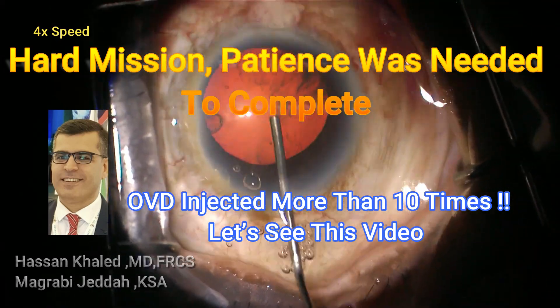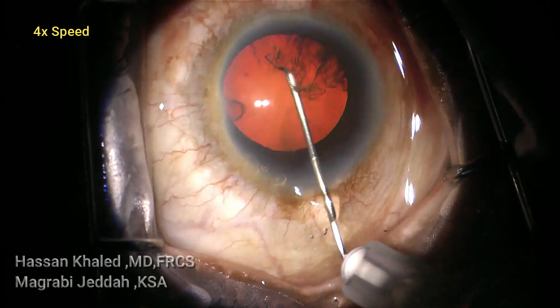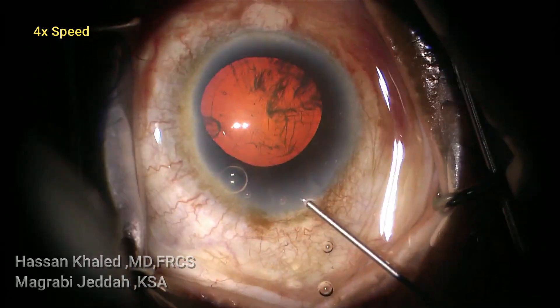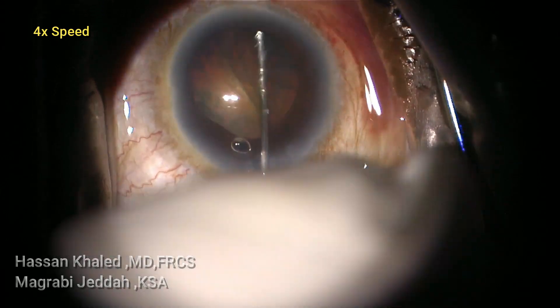Here a case of dense nuclear cataract for an 80-year-old male patient with very well dilated pupil. As usual, started with a 2.2mm clear corneal incision, injecting dispersive OVD, then doing about a 5.5 millimeter capsulorrhexis.